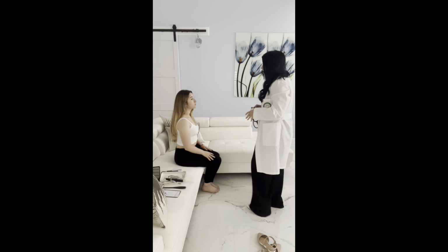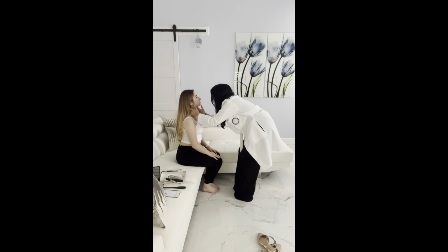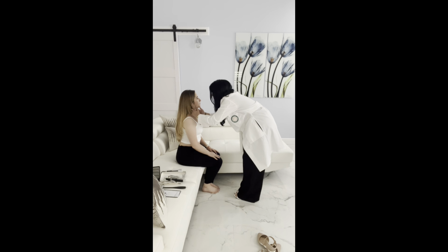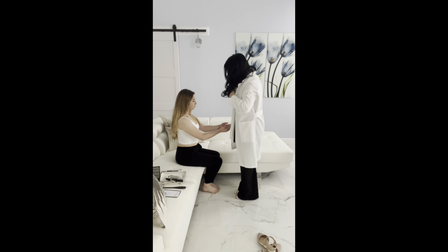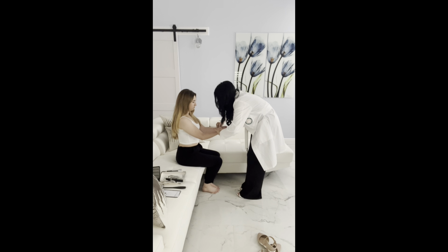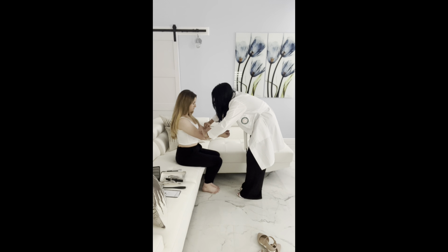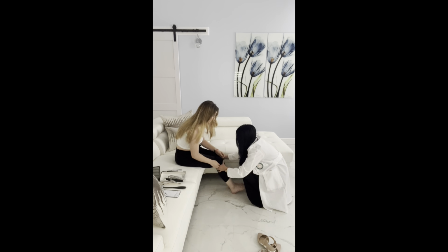I am going to auscultate your carotid arteries, and I'm going to do that using my bell, okay? Perfect. All right, the next thing that we're going to do is move on to your pulses. So if I can please see your hands. Okay, now I'm going to go.